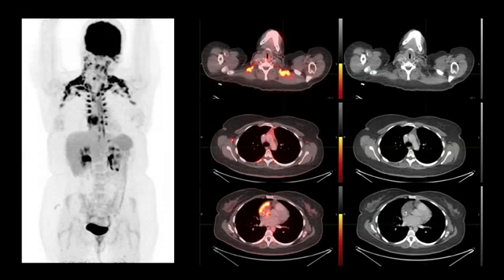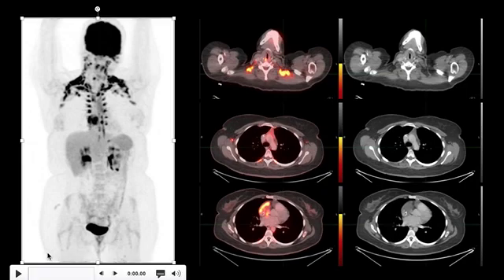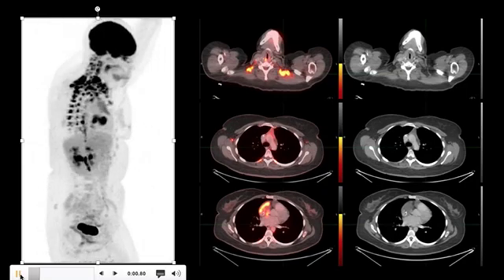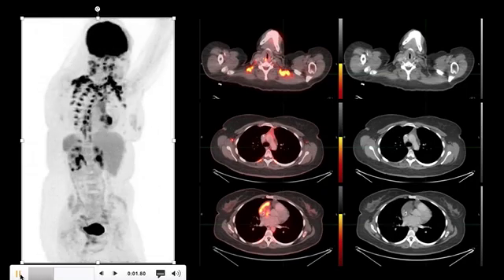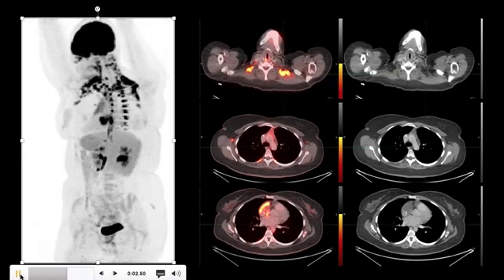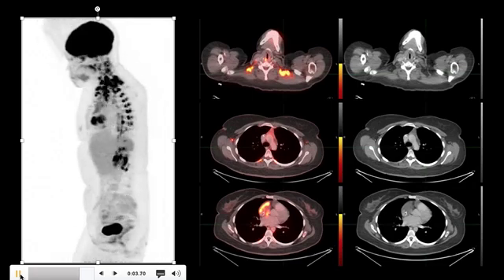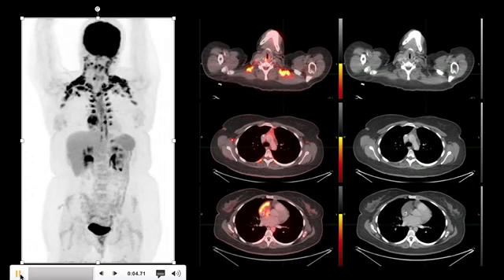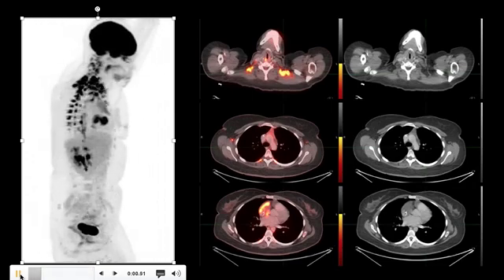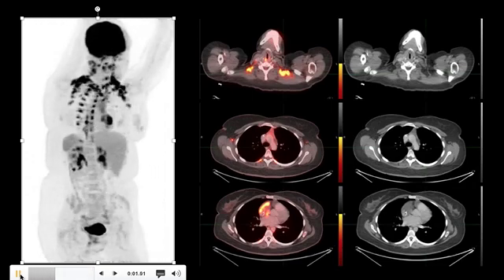Hi, this is Piyush Prakava and I have an interesting case to share with you. Let's start by reviewing this rotating FDG PET CT scan. This is a great case because it shows a rare pathology and also several areas of physiologic uptake.